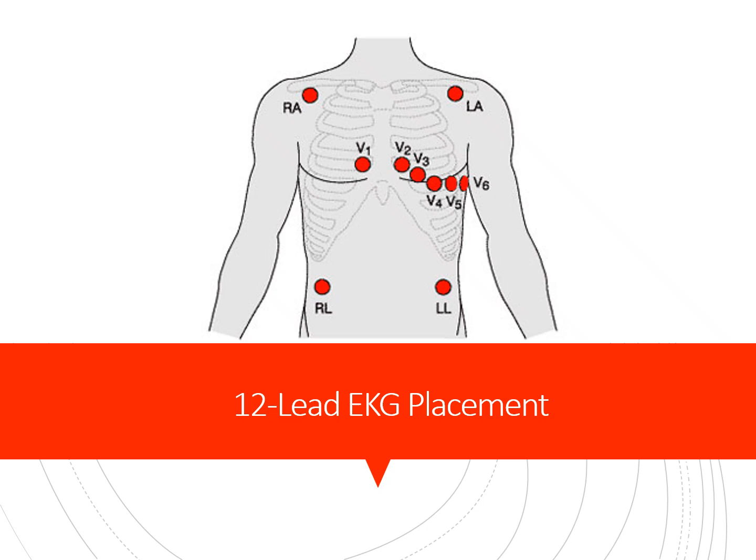Starting with the precordial leads, V1 through V6, these give us a horizontal view of the heart. As you can see in the diagram, V1 is placed at the fourth intercostal space on the right sternal border. V2 goes on the left sternal border at the same level. V3 is between V2 and V4. V4 is at the fifth intercostal space in the mid-clavicular line. V5 and V6 continue at the same level along the anterior and mid-axillary lines. These chest leads are crucial for detecting anterior and lateral wall ischemia.